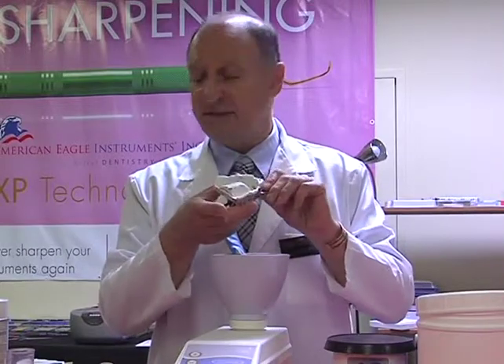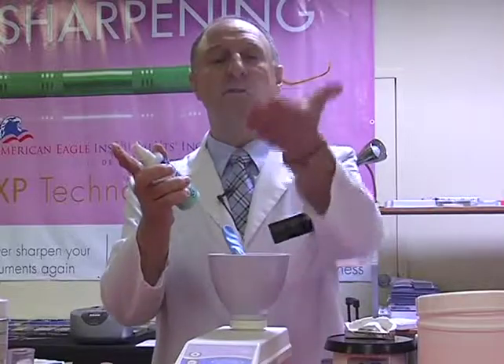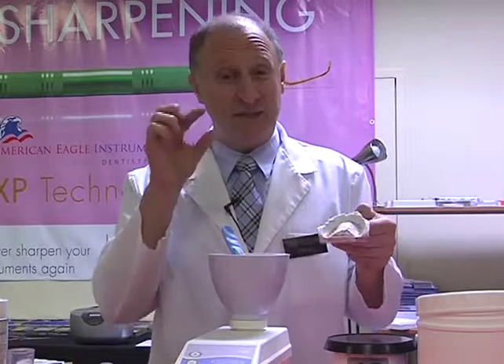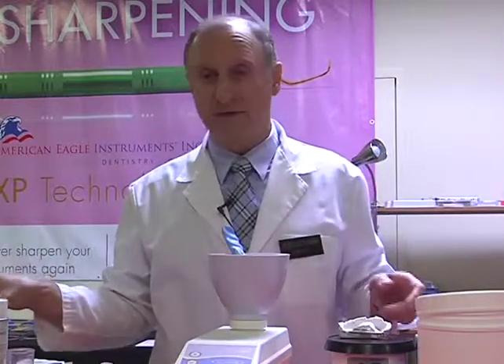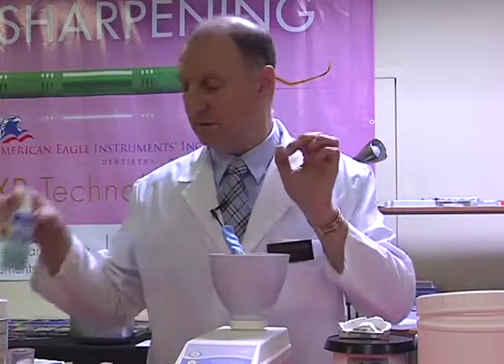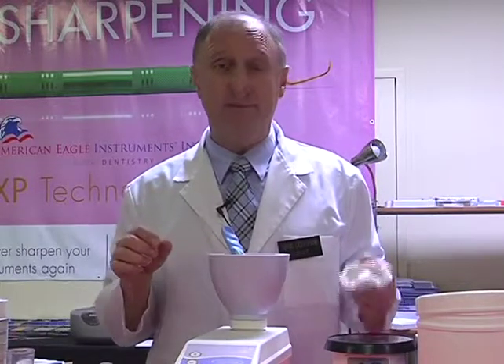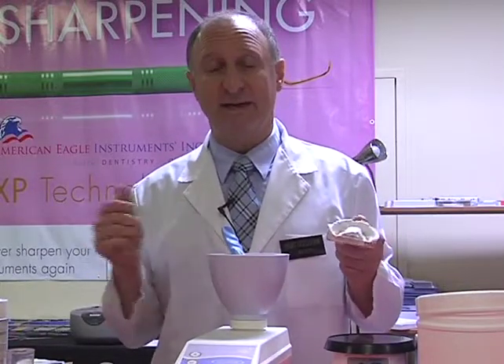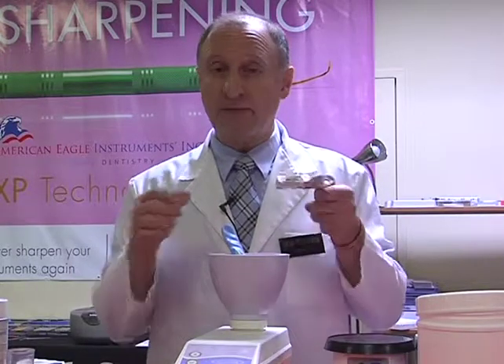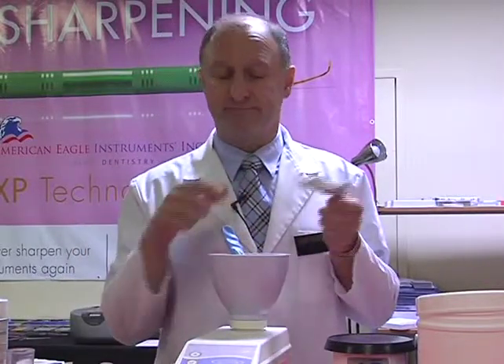We'll spray it with a disinfecting spray, but making sure that if it's a very fine spray, there's no way that a fine spray will reach the bottom part, especially for lower anterior teeth that are long and narrow. So if it's possible on a sprayer and it has a chance of changing the coarseness of the spray, do so, because we want to have large particles that are entering down inside. The contact time is again according to the manufacturer of our disinfecting solutions. So normally it's anywhere from 5 to 10 minutes. Then we rinse it under the tap, shake off the excess, and then we're ready to pour.